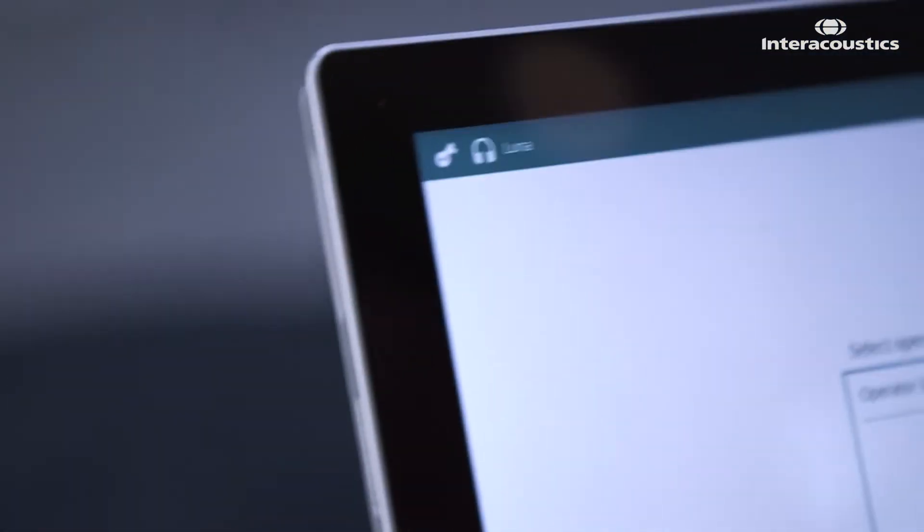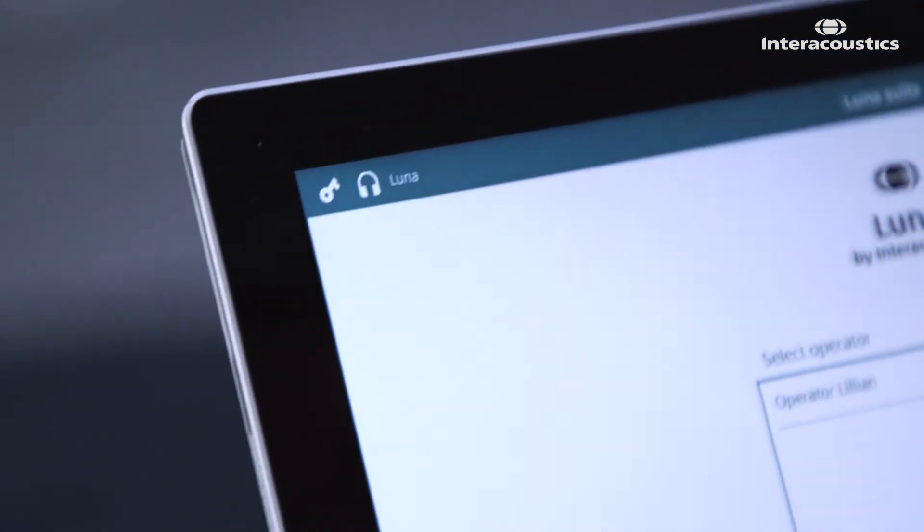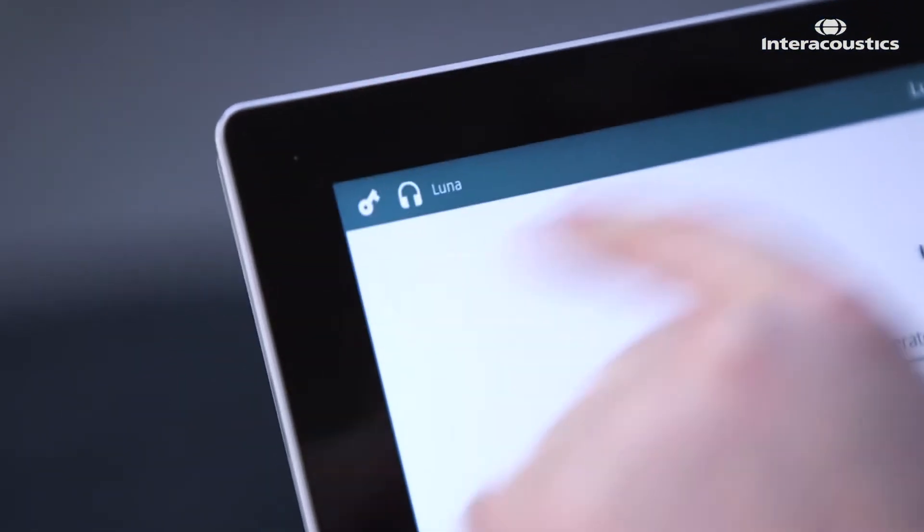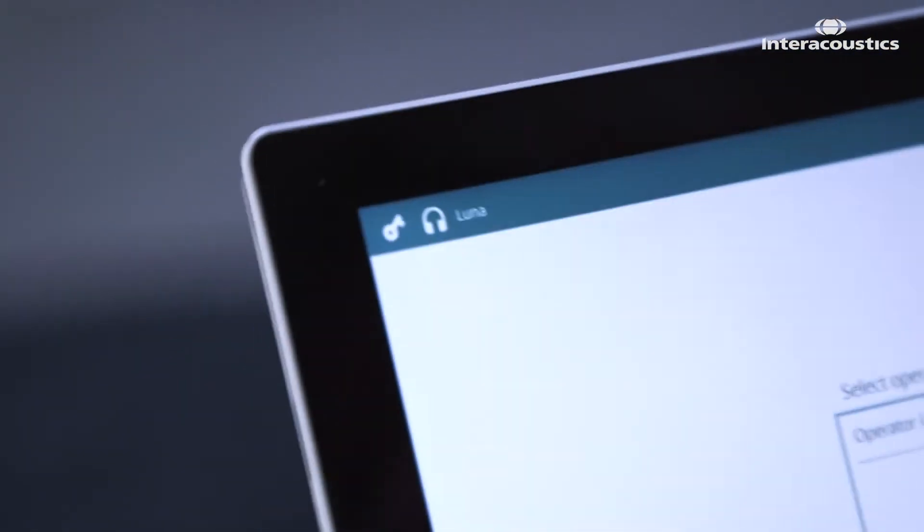So you plug the device into the tablet itself and we can then see up here in the corner that Luna is now connected. And from that you have the Luna Suite running where you can control the system and start the test.